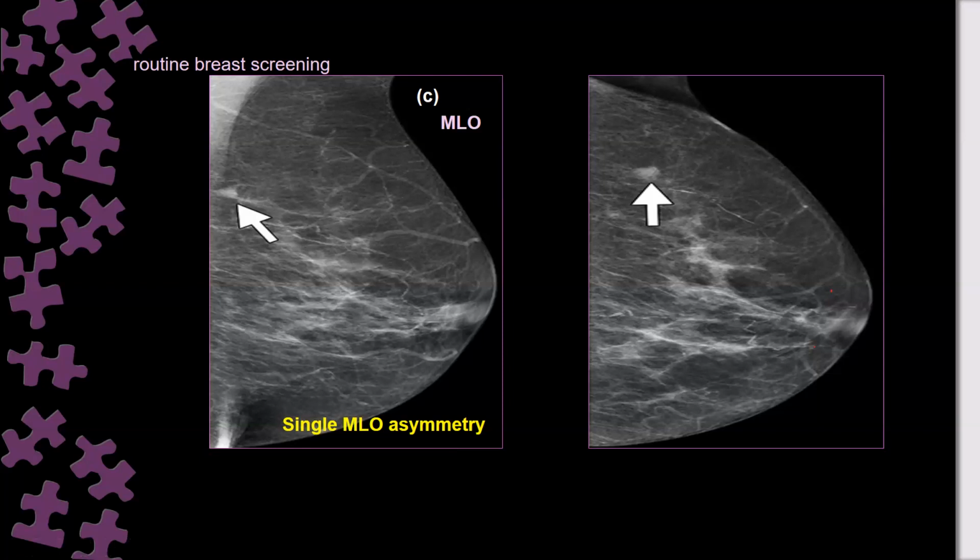What is the next thing I have to do? Because the lesion is in the extreme posterior superior portion, it is very unlikely to be in the medial breast. There is no need to do a lateral view to make sure, to do all this triangulation. We are going to do the triangulation, but when the lesion is in the extreme superior posterior, I expect it to be lateral. I'll go directly for the extended lateral.